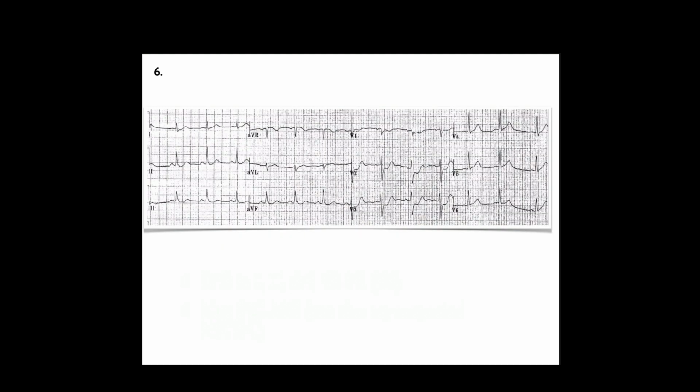Okay, Chris, you next, please. Number 6, right? Mm-hmm. Let's see. Looks like a tiny bit of ST depression in 2, and V1, yeah, V1, V2, and V3 as well. And I think that's it.